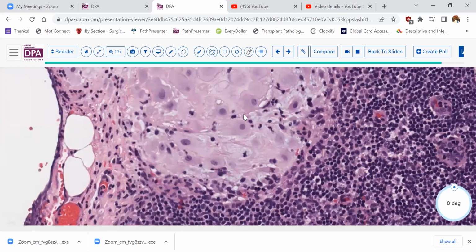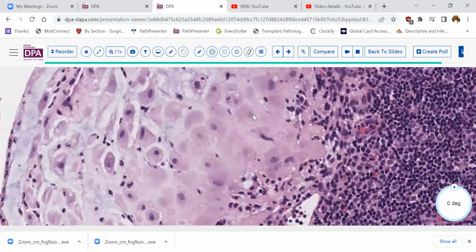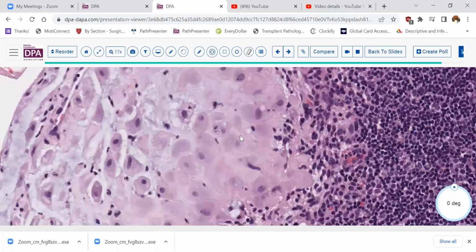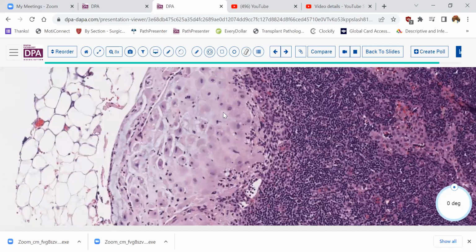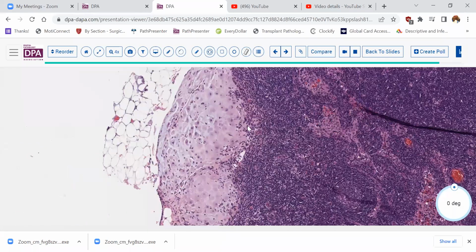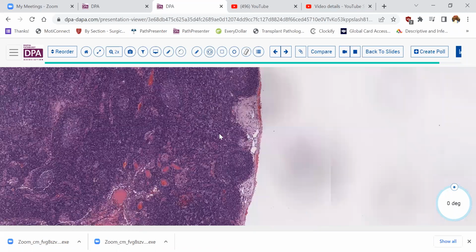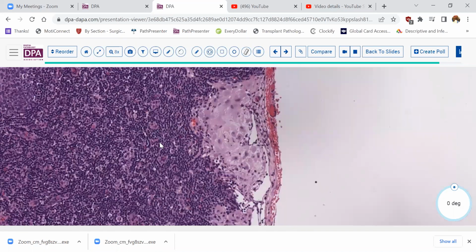So is this metastatic cancer from the patient's cervical cancer? At first glance, you might say, well, it could be, looks like that. And you could even do some immunostains, maybe cytokeratins, or even things like P63. And oftentimes these cells would light up with those immunohistochemical markers. And if you use that as a criterion to define this as micrometastatic disease, you would have fallen into a somewhat challenging but understandable pitfall.